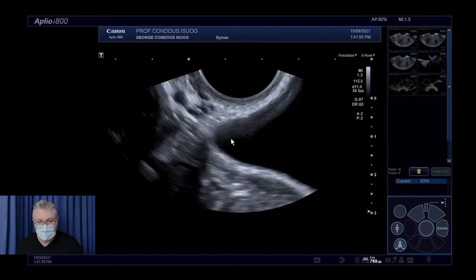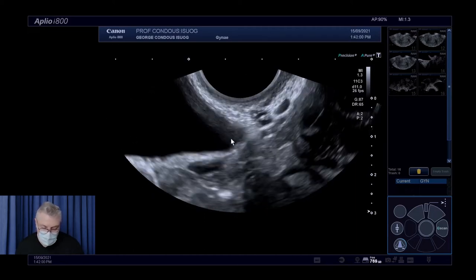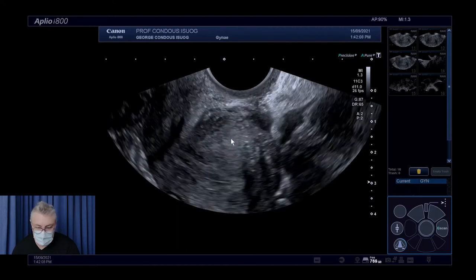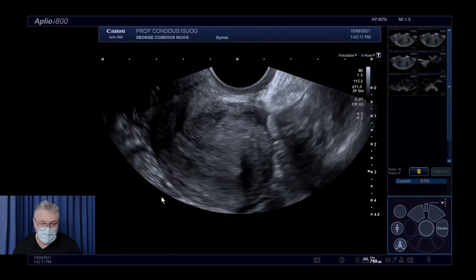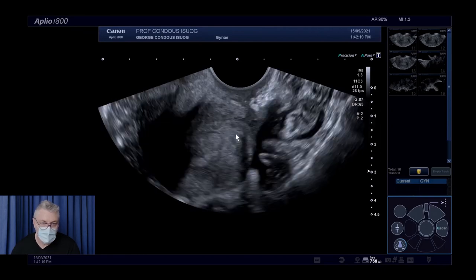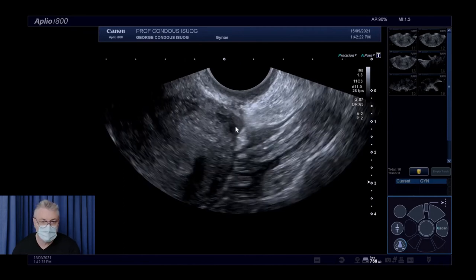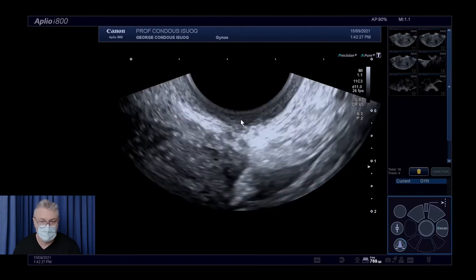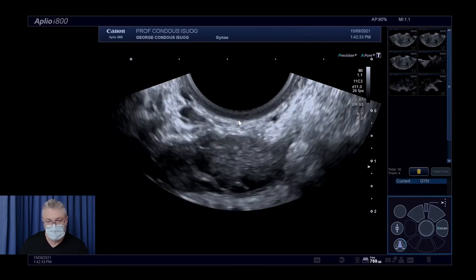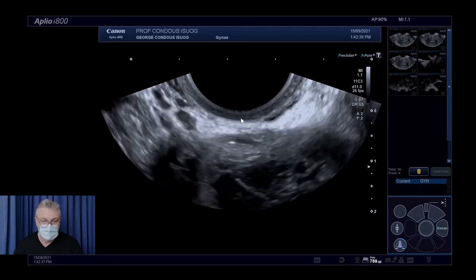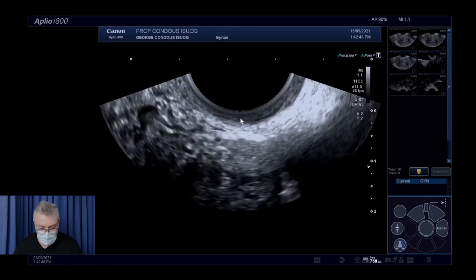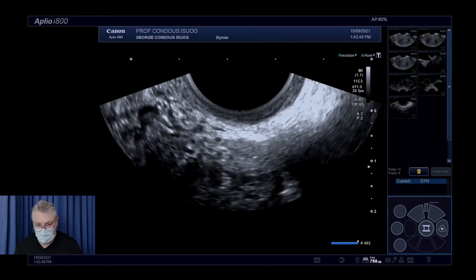We've assessed the uterus, ovaries, and ovarian mobility, and now we need to look at ovarian mobility in relation to the utero-sacral ligaments. Coming into the posterior compartment, we know there's a rectal lesion fixed to the posterior uterine fundus. First, I look at the vagina — the sonolucent area — maximizing the view, swinging to the left posterolateral vaginal fornix, back to midline, then to the right posterolateral vaginal fornix. In this situation the vagina is normal — no obvious vaginal endometriosis, which is good.